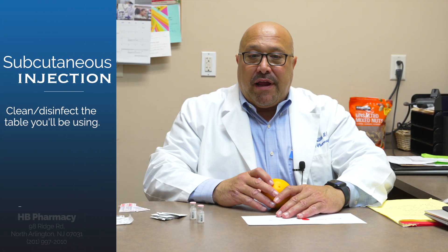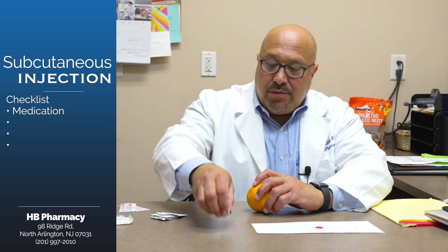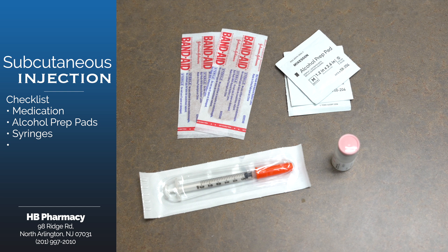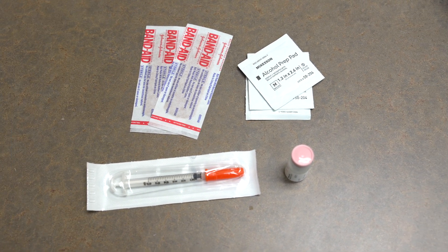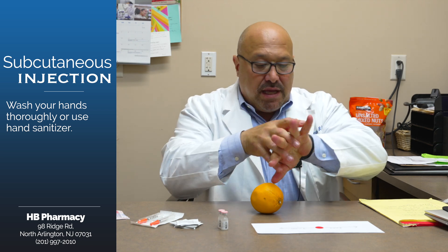First thing we want to do is always clean our area in front, and we're going to get all of our things out. We have our medications, we have alcohol prep pads, we have our syringes, and we have band-aids if necessary. I like to wash down my counter, and I also recommend always washing your hands thoroughly. In absence of that, you can also sanitize well.